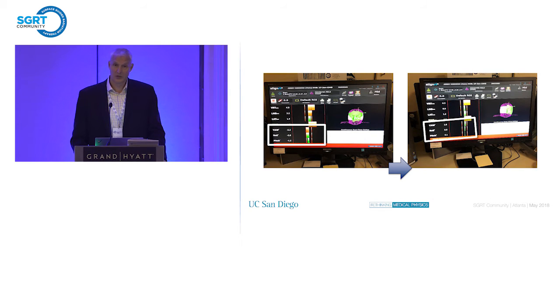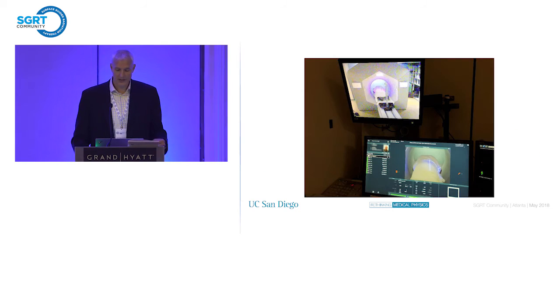And what they're trying to do here is not necessarily get the patient perfectly positioned, because the patient doesn't have the mask on at this time, but they're trying to focus on the pitch, roll, and yaw, because we don't have a 6-degree couch on the Halcyon. It's just a straight translational couch. And so they're primarily looking at pitch, roll, and yaw, and getting the pitch, roll, and yaw within the limits. And once that's in there, they put on the mask, and they go outside the treatment room, and the patient slides into the bore for treatment.